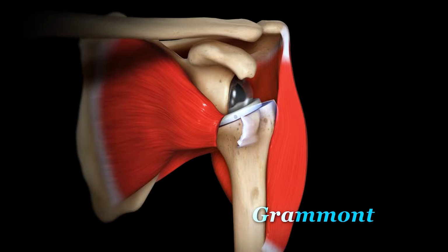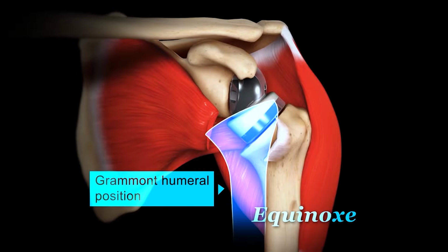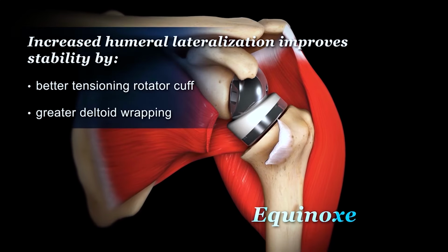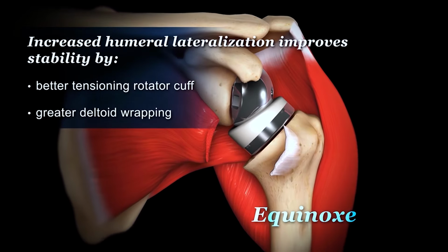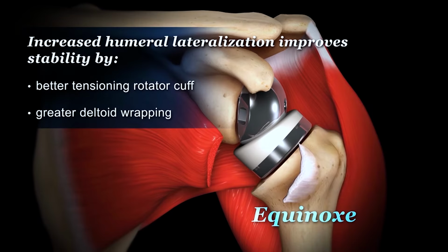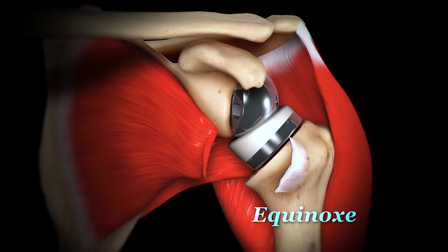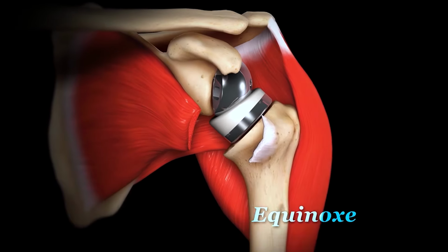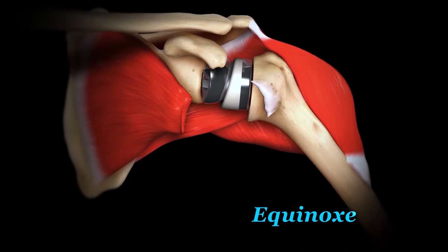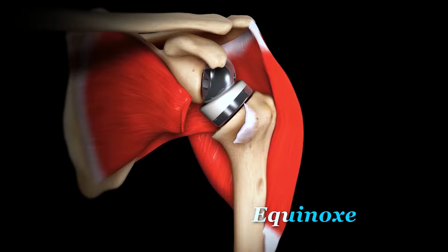However, subscapularis repair may not be necessary for stability for alternative prosthesis designs that lateralize the humerus more. Thus, recommendations for subscapularis repair are not universally applicable to all reverse shoulder designs. The requirement for repair is dependent upon humeral positioning. Not repairing the subscapularis with lateralized humeral designs may reduce the force required by the deltoid and reduce the overall joint reaction force, since the subscapularis no longer functions as an adductor.